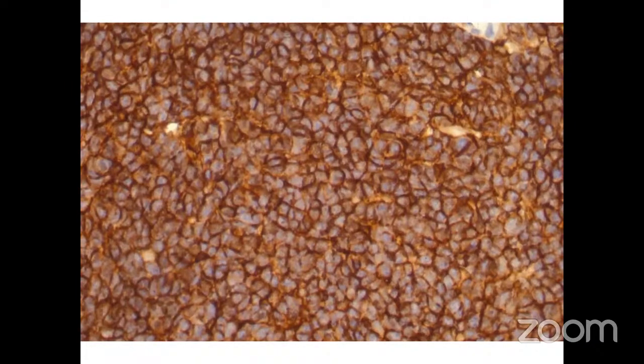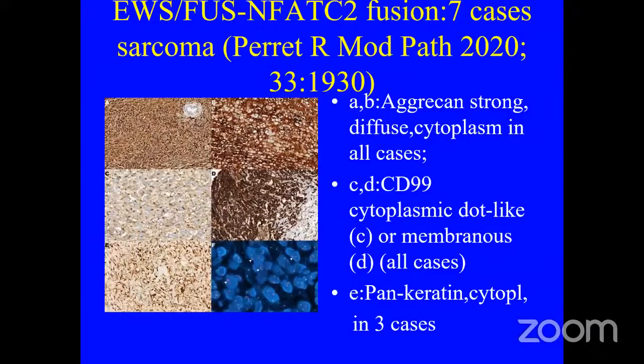Notice also that when you are looking at these slides of immunostains, you can also see the features of routine histology, which enable you to get some idea as to what type of tumor you are dealing with. I will not go into the details of this. I have already told you about this. So you can remind yourself of what those features are, and also try to note these in these slides, in which I'm mainly emphasizing the ICC markers. This is just to show you that CD99 can be positive in non-ES.